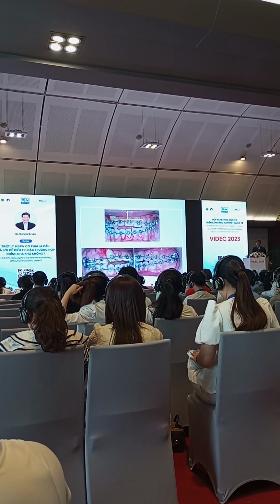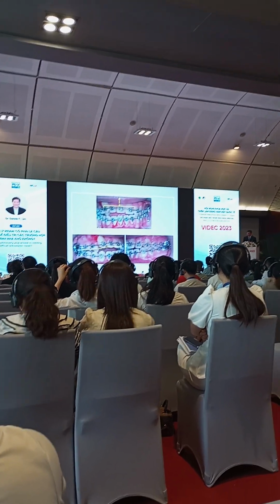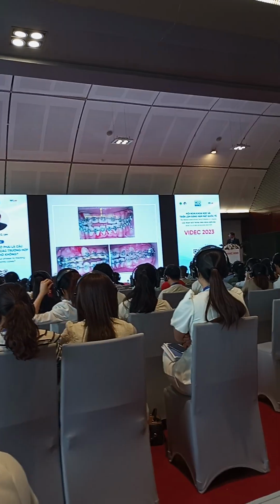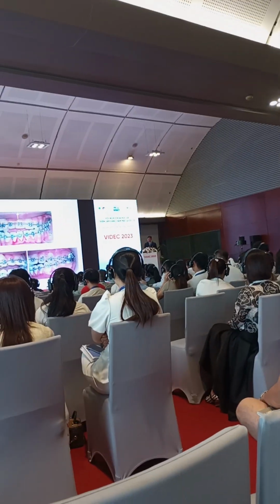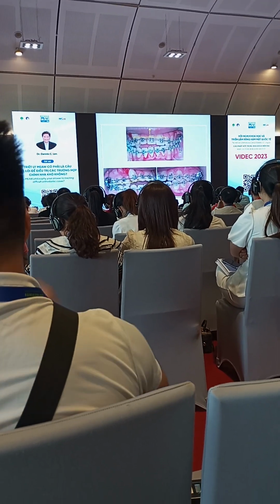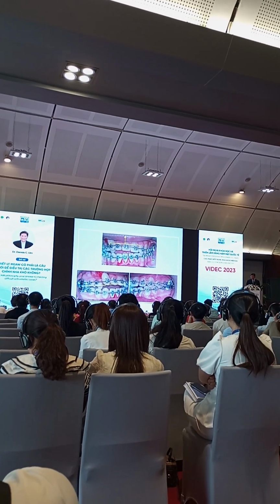Okay, but of course with lots of prayers, okay, I changed again to a nitinol wire and tried to re-level it again. Okay? So as I mentioned, there's a recession of the gingiva, and it happened. Okay? There is a marked recession of the gingiva on the canine area because of a very thin gingival biotype for this particular patient. So, but the parent accepted it.